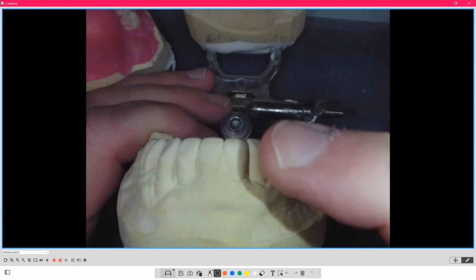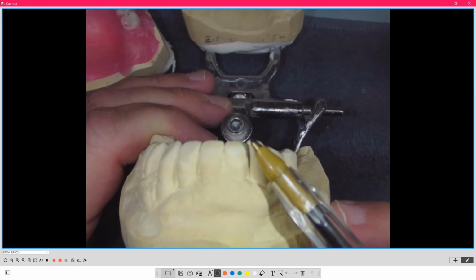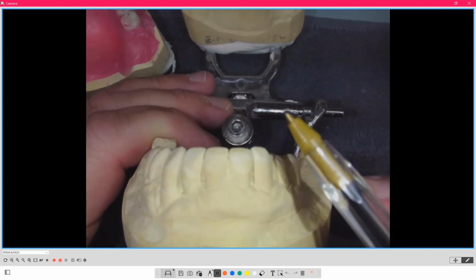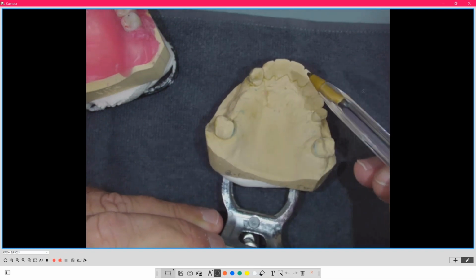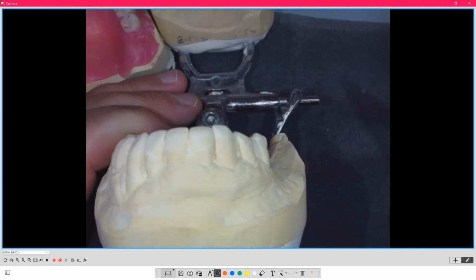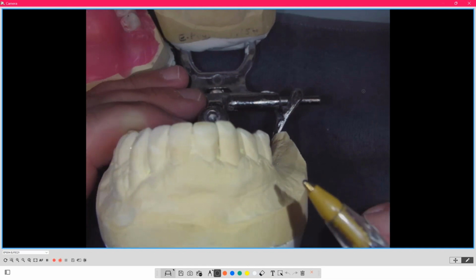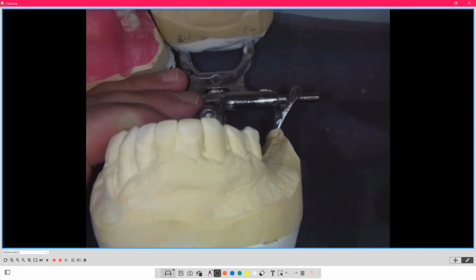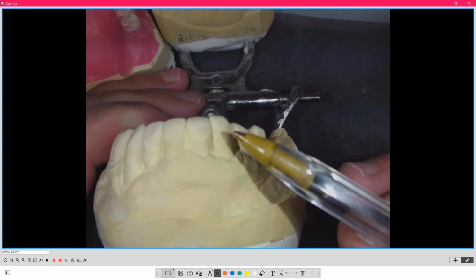And when the patient is chewing, it's contacting, but because there's less proprioception, which is a fancy word for there's no nerve in the denture and denture teeth, they can't feel it as diligently and as accurately as, say, someone with a full complement of teeth. They can't tell, and they break it out.